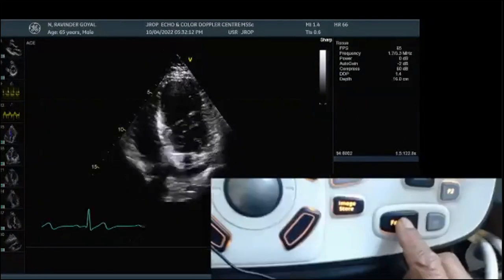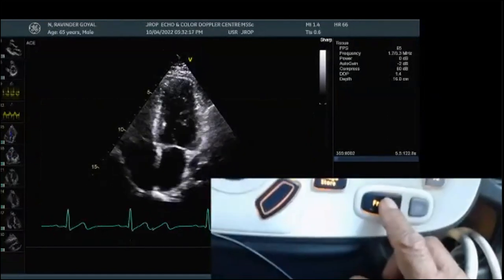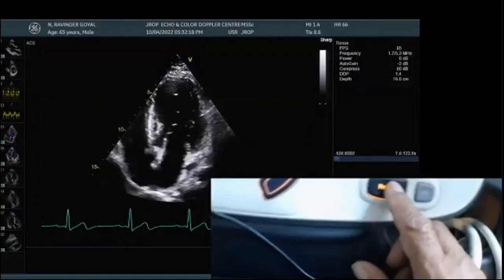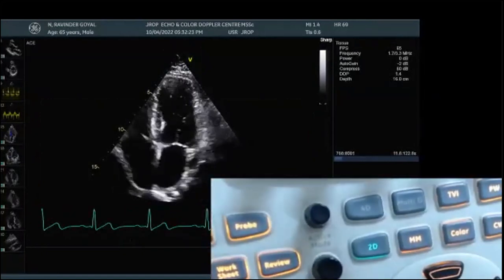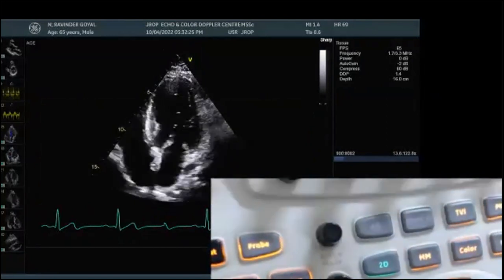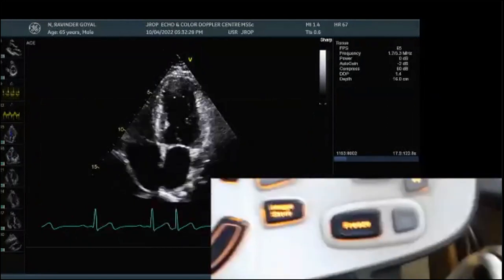So I think whatever we wanted to show from Doppler and color flow mapping, I've shown you. And I'll now take up questions one by one so that you can really look for the complete answers for these things.